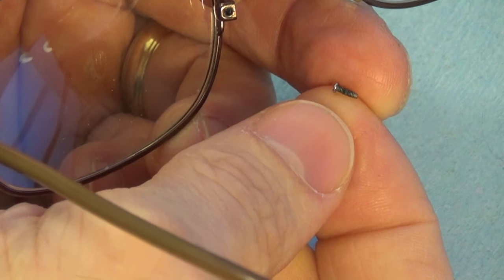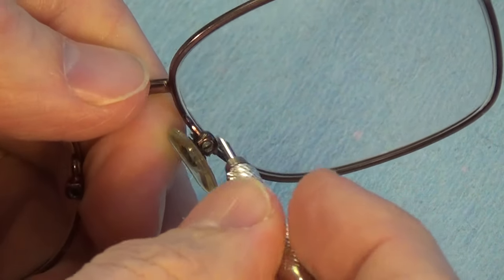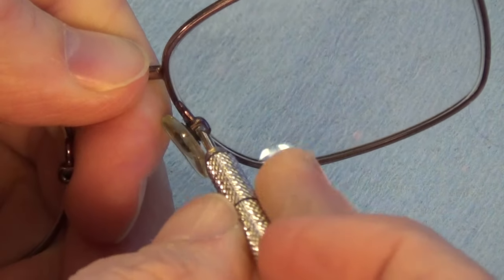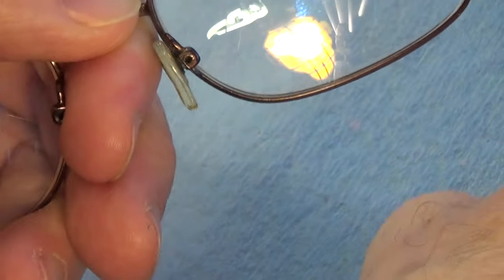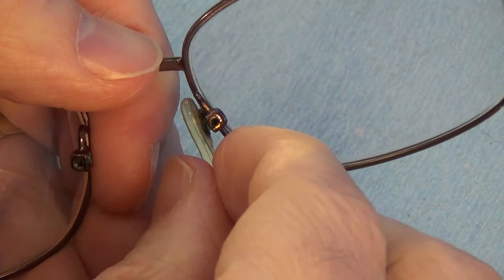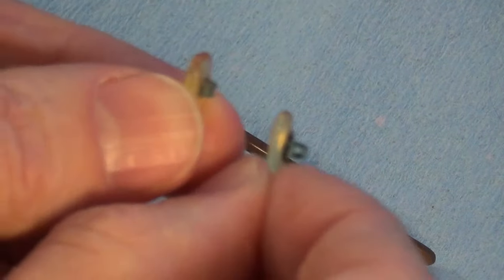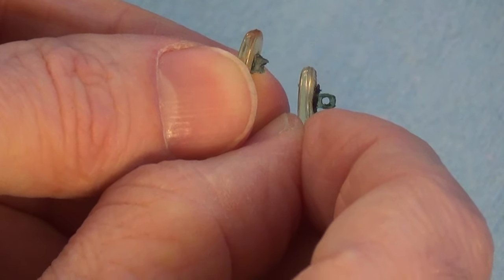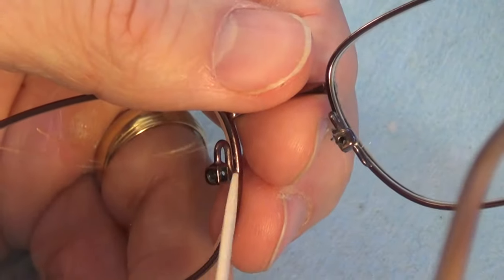That's the first screw out. Removing the second screw releases the remaining pad. You can now see the difference between the two pads — one still has the hole intact, while the other's ring broke off.